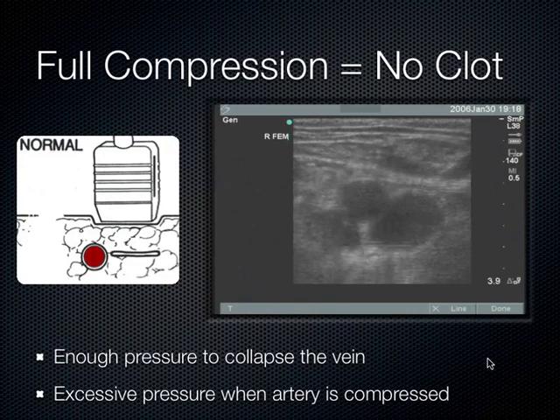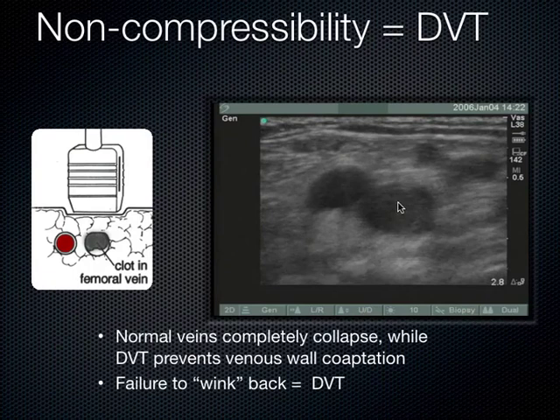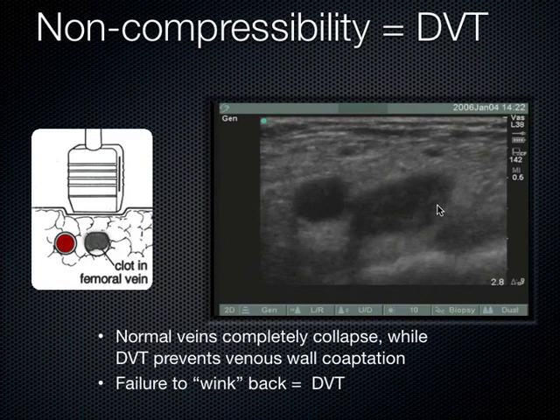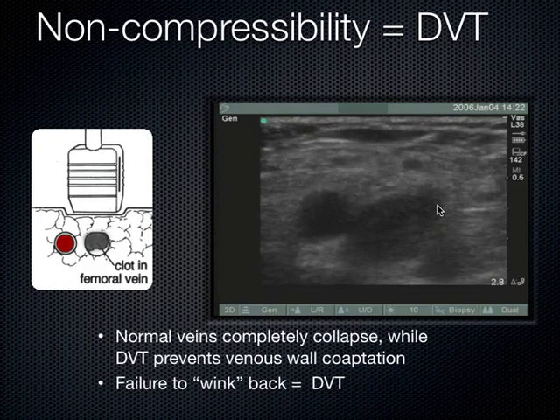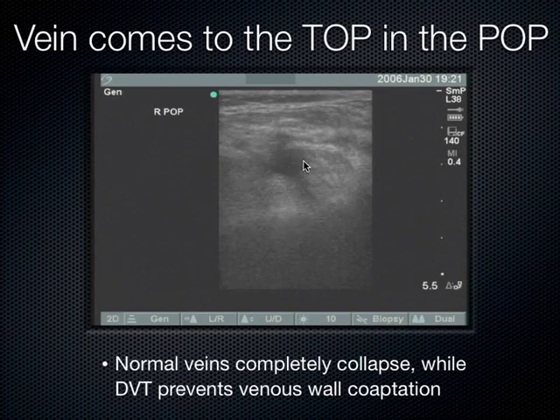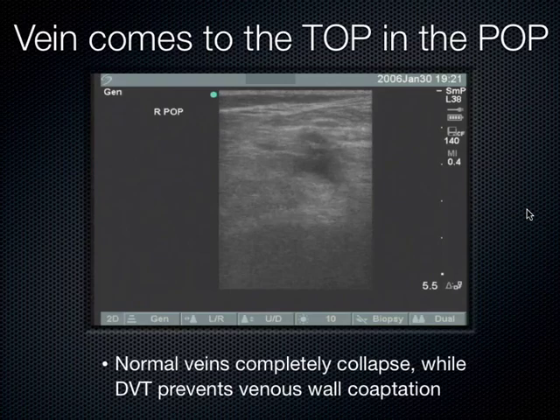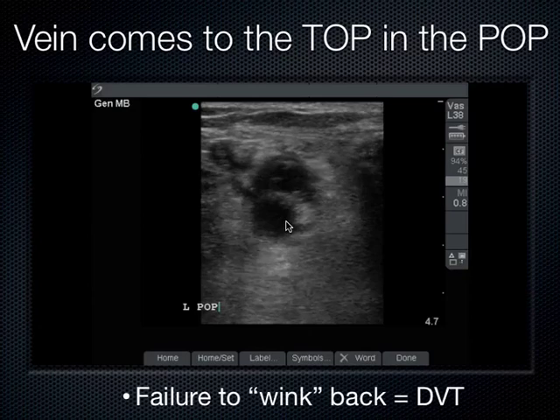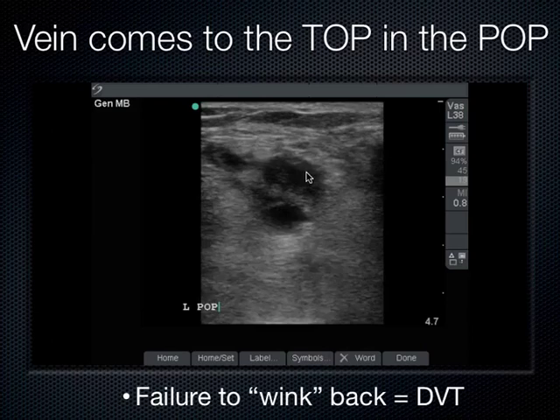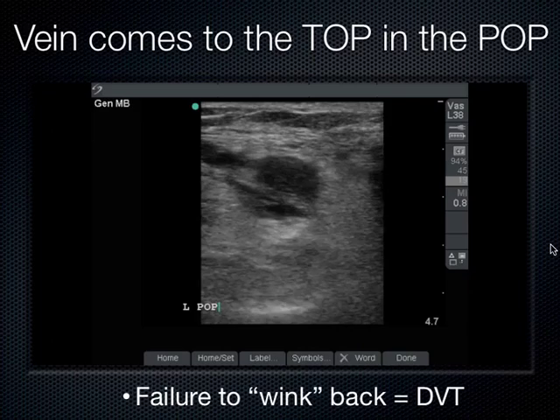A non-compressible femoral vein means DVT. Once you identify a clot, stop compressing — you don't want to dislodge it. Capture video and images, then notify the team. In the popliteal fossa, a normal study shows the vein compressing fully while the artery remains open. A positive popliteal DVT shows the vein non-compressible; sometimes you compress so hard the artery starts to 'wink' back — that's pushing too hard. Once you have the diagnosis, stop moving the probe.